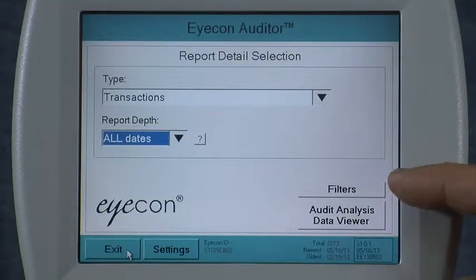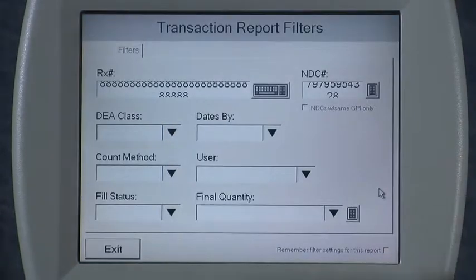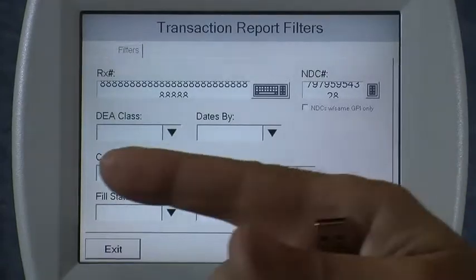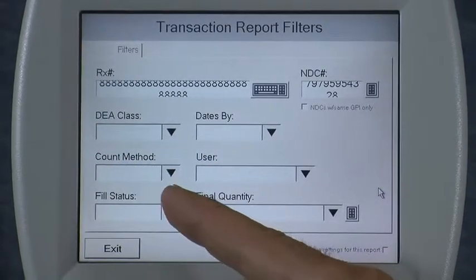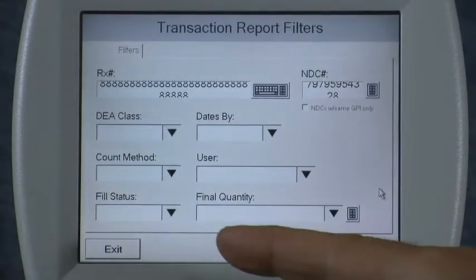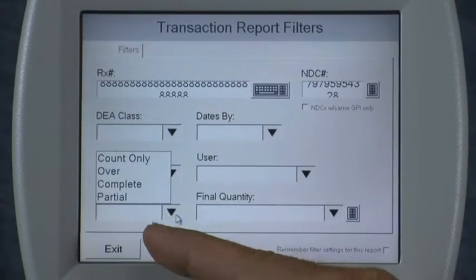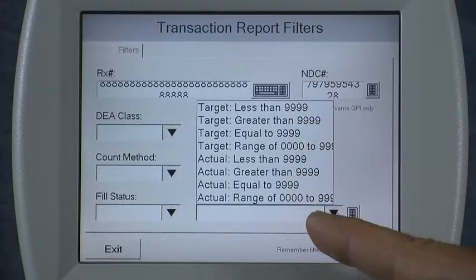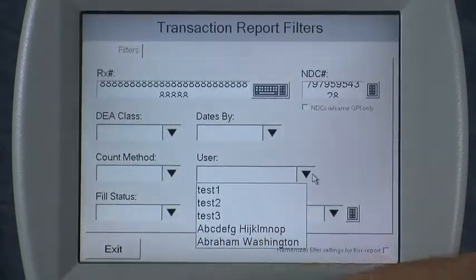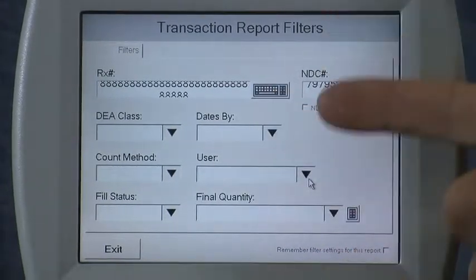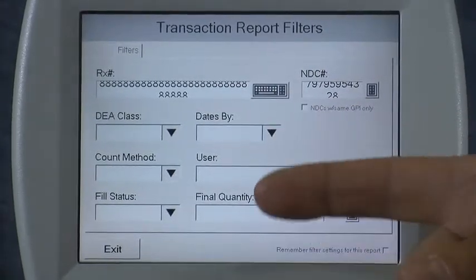I can select a variety of different filters in order to analyze the data and only include the transactions of interest. For example, I could do an audit report that only shows C2 and C3 drugs, or only show ICON-counted pills as opposed to non-countables dispensed through the ICON. I can only show partial-filled prescriptions, or pills counted above a certain quantity, or prescriptions filled by FRED, or all prescriptions filled on specific dates.